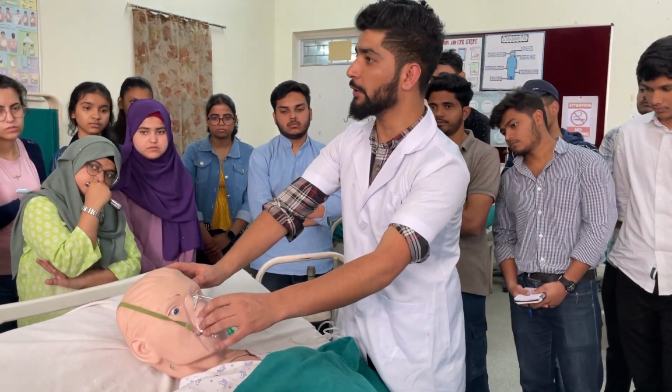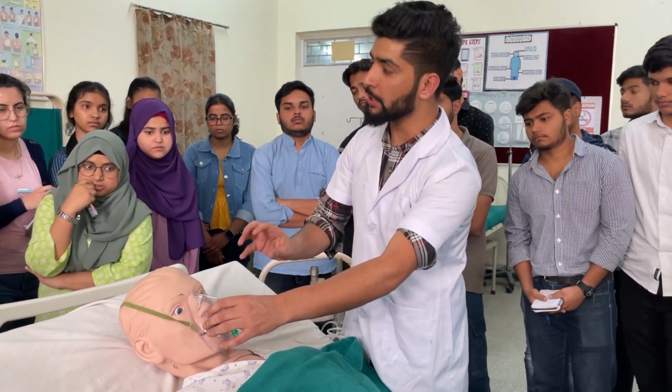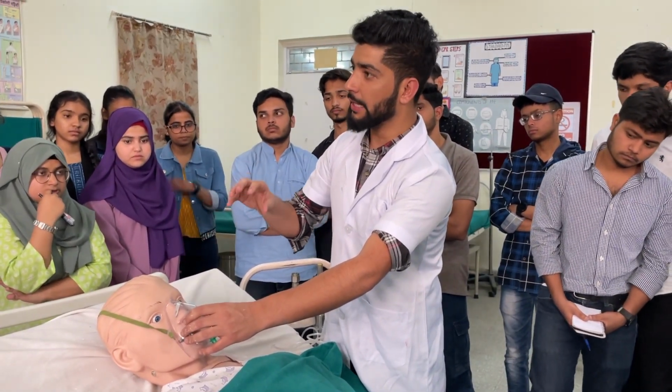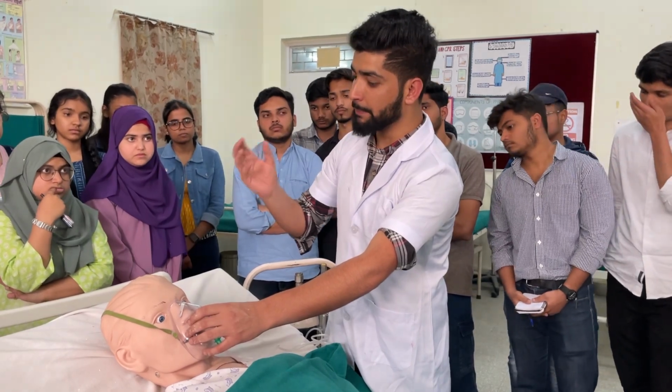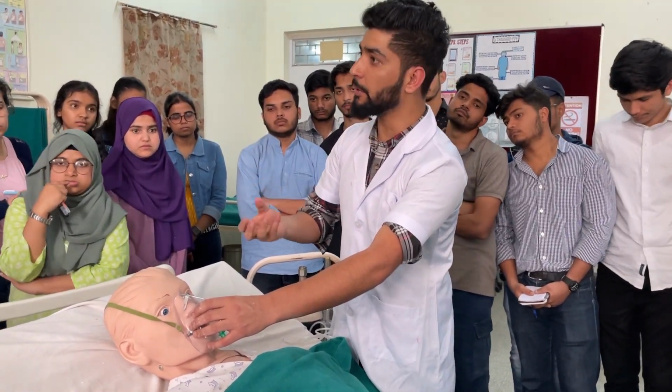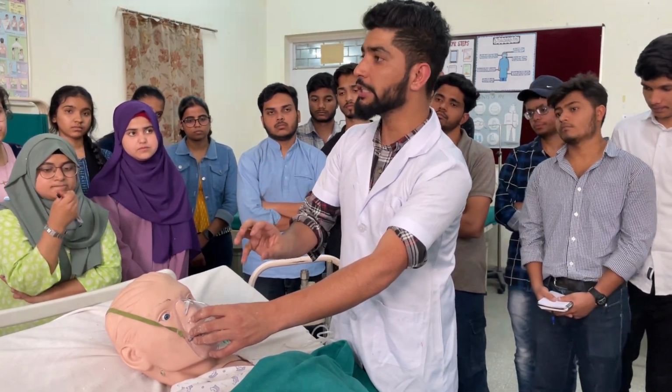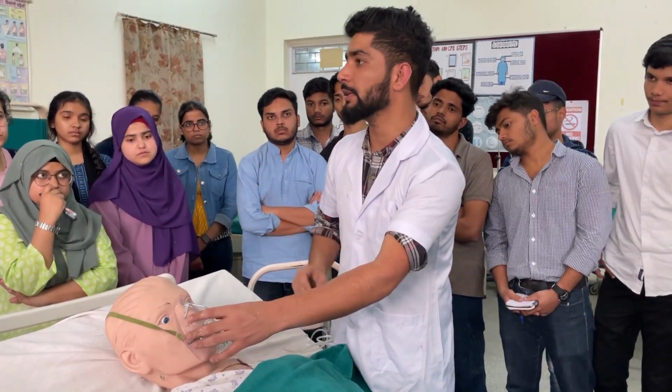So this is the procedure. We have to provide constant oxygen therapy to the client according to doctor's order. After that, when the oxygen demand of the body of the client is complete, then we have to discontinue, or we can say stop this procedure.